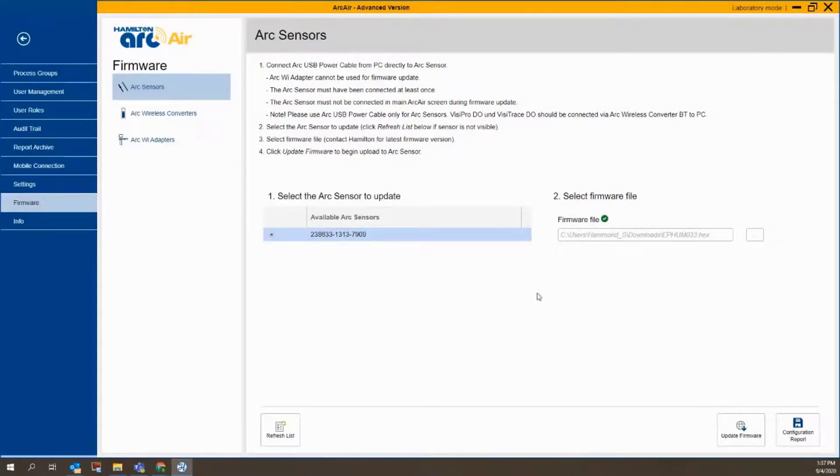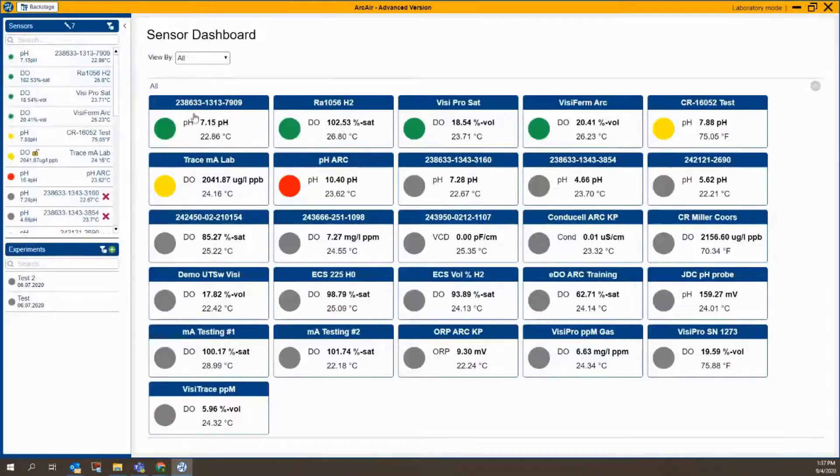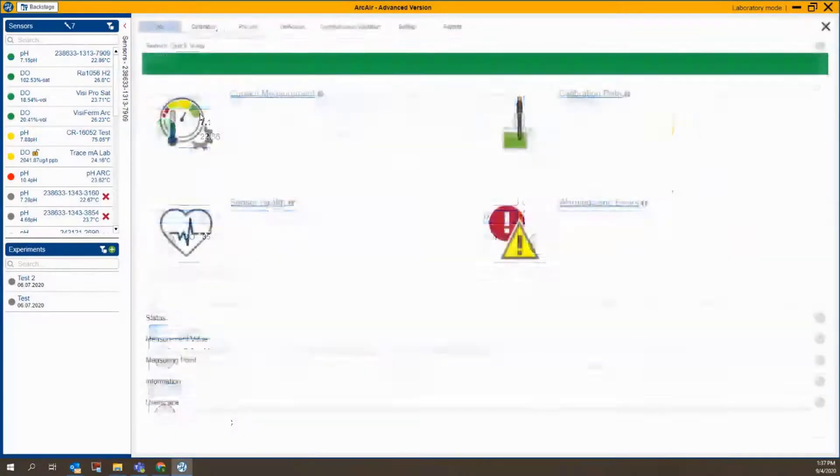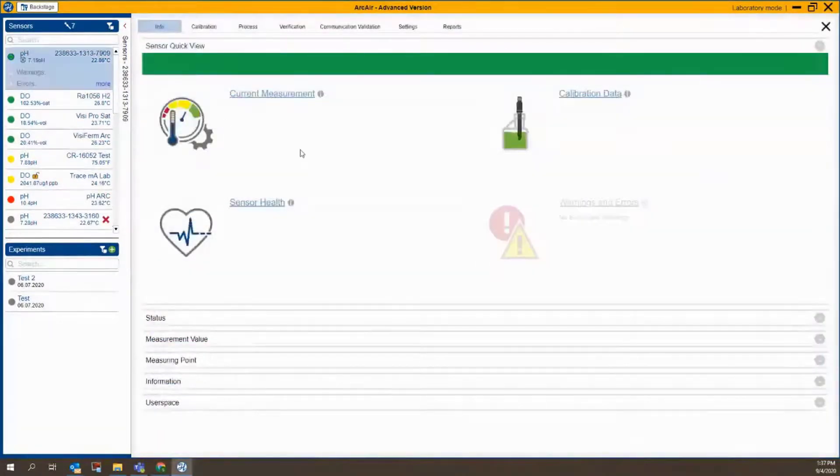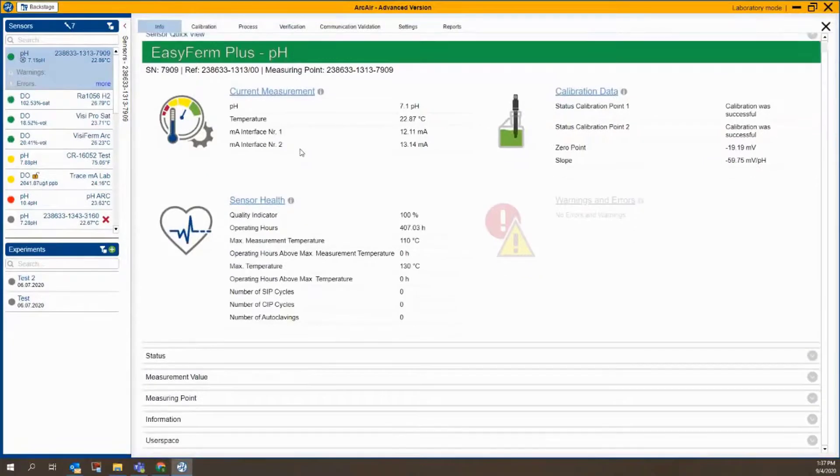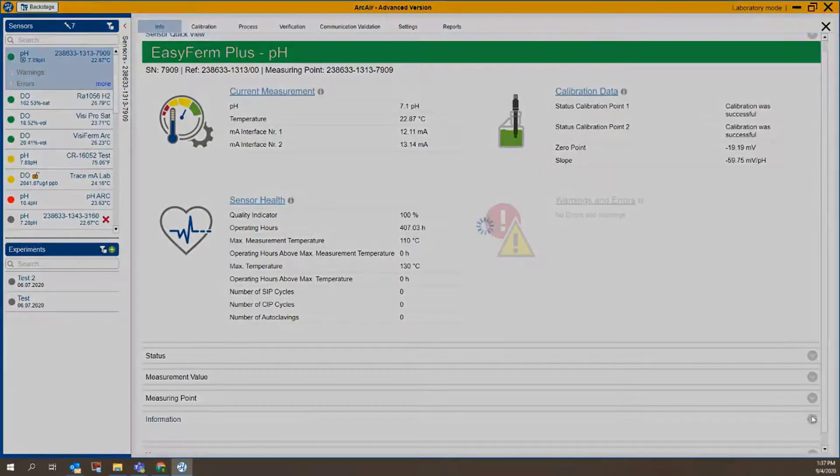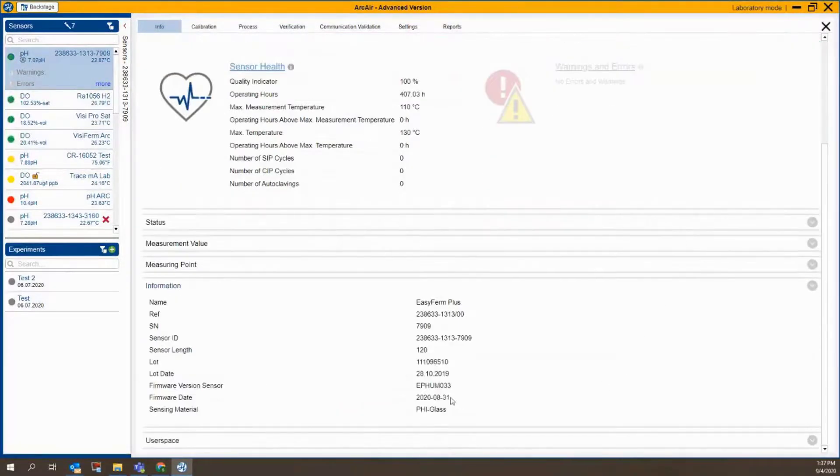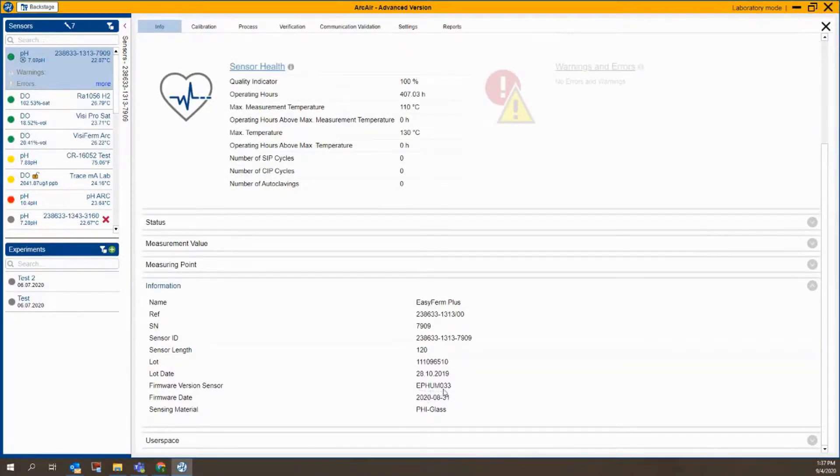The thing I usually suggest afterwards is to go back to the sensor just to verify that the firmware has been properly updated. So we'll go back and click on it here. We can go back down to information here, and there we go. It is now EPHUM033. The firmware has been revised.